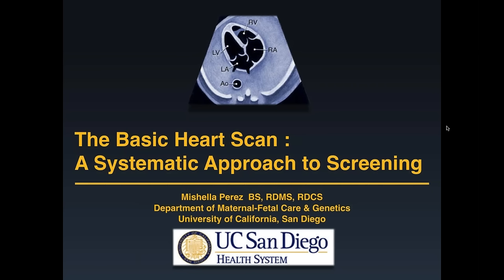I hope I answered her question. And then we have one that someone's saying they're still a little confused on how to determine PDA. Is that the patent ductus arteriosus? You mean to determine between the ductus arteriosus and the... I'm not really quite understanding that question. All right, well, maybe they'll write again with some clarity. If you're talking about just the ductus arteriosus, you have to go into the ductal arch view and you're able to see it there. If that's what they're talking about, I'm not too sure how specific.